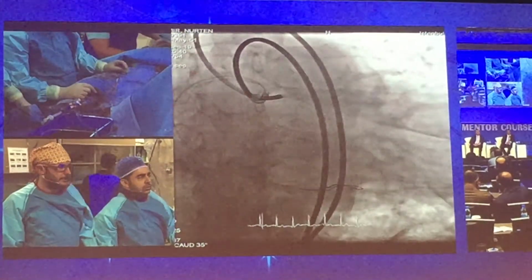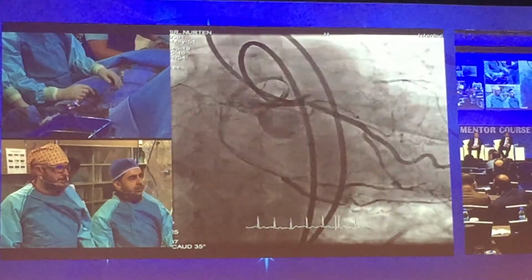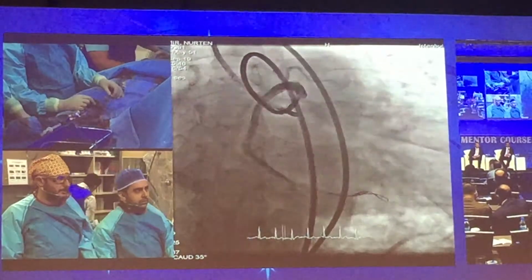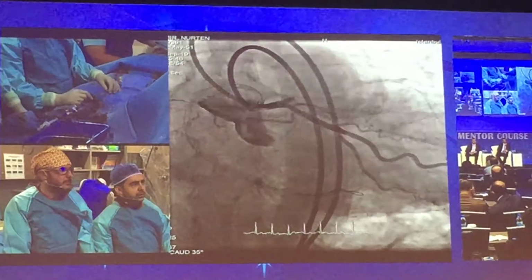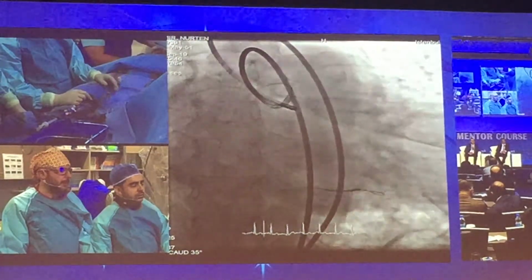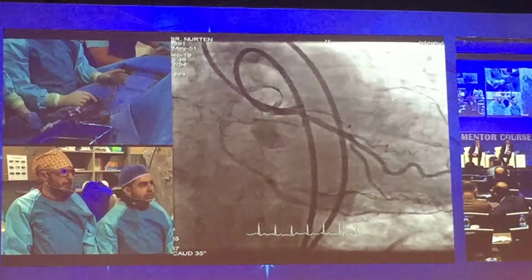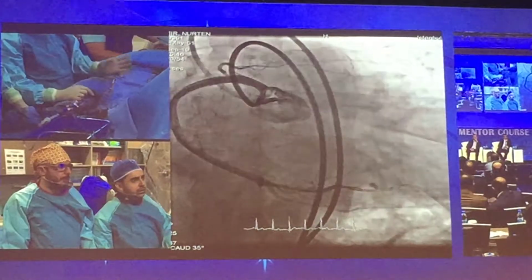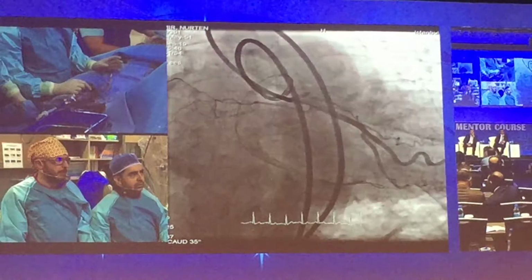We have an in-stent case. Can you see our case is a long-segment in-stent CTO case? Okay, move on please. Go on. Yes, we are listening to you. C2 case. Yes, there is no clear microchannel. However, we know that in this case there may be an invisible microchannel.